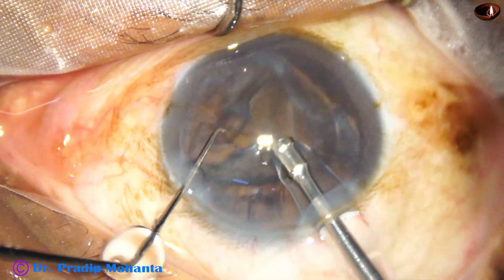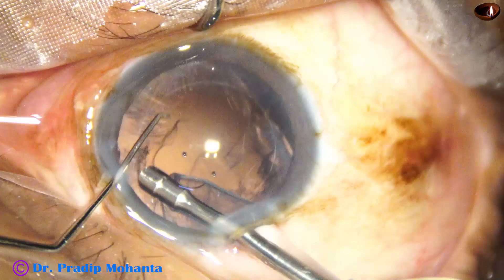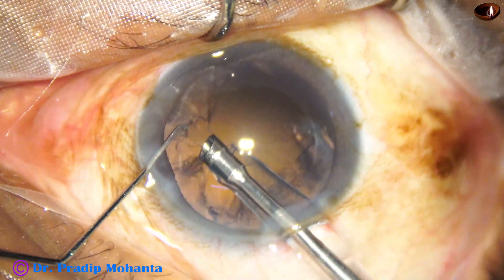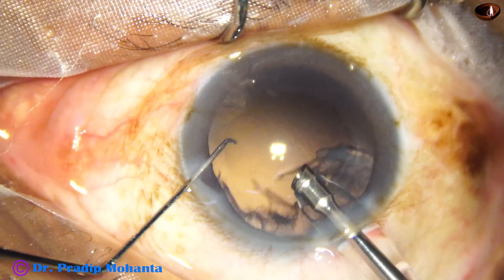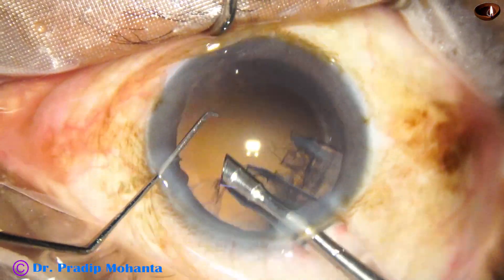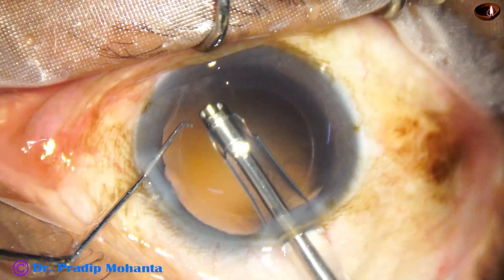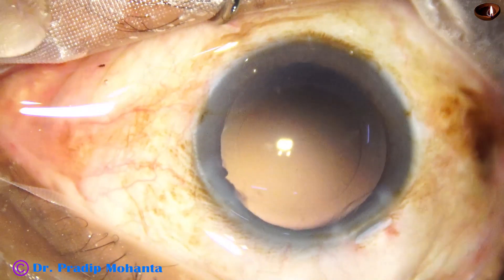The nucleus is managed and the nucleus is removed. Now watch removal of cortex by the handpiece itself. You have to be very careful at this time and keep an eye on the posterior capsule. You must not catch the posterior capsule. If you happen to catch it, stop then and there, use reflux and release it. The vacuum at this time is 350 and flow rate 35 in IA mode — irrigation aspiration mode.